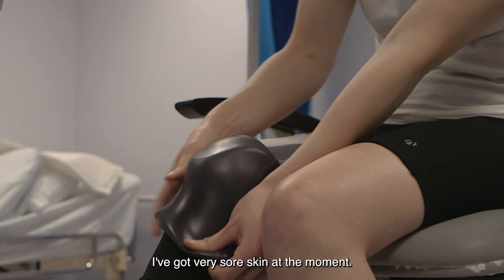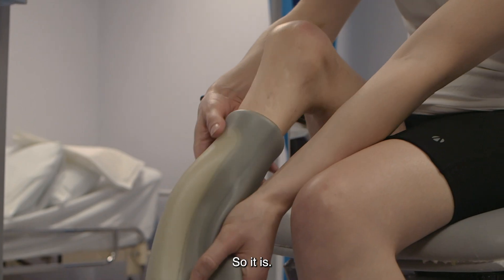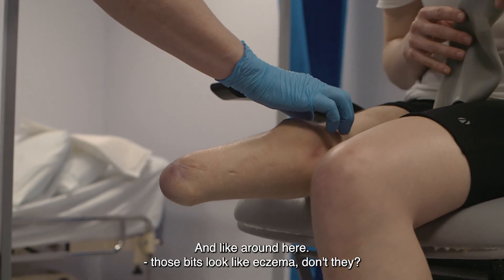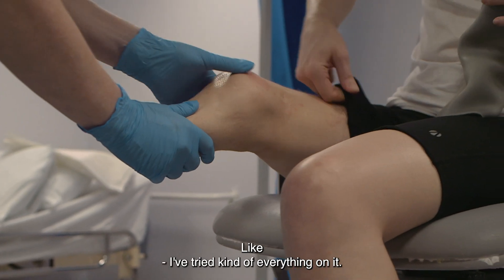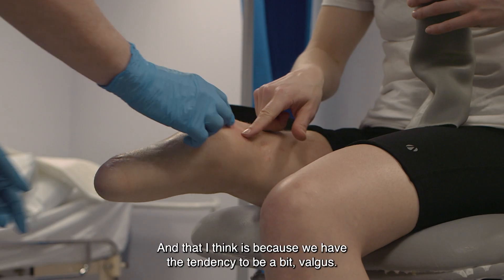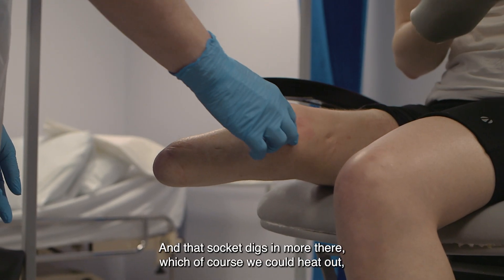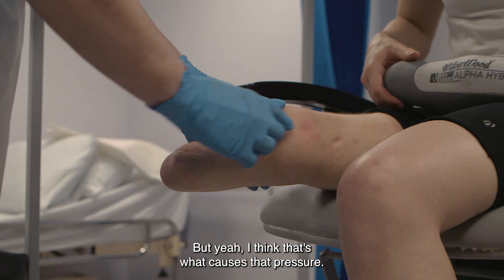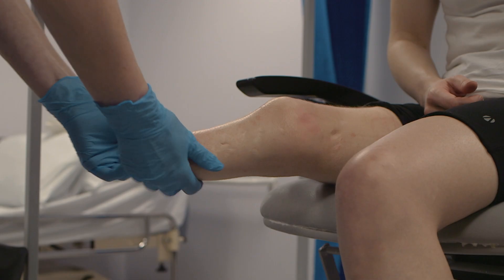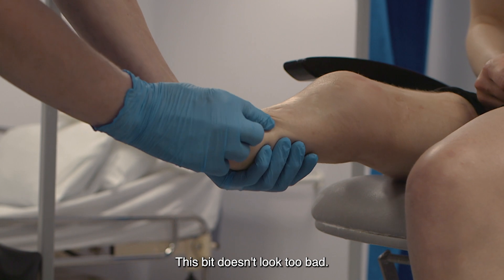Do you want to take that leg off now? I've got very sore skin at the moment — it's quite bad actually. Those bits look like eczema, don't they? I've tried kind of everything on it, it just doesn't really help. I think that's because we have the tendency to be a bit valgus, and that socket digs in more there. Which of course we could heat out, but you'll have a bit more of a gap there. I think that's what causes that pressure. This bit doesn't look too bad.